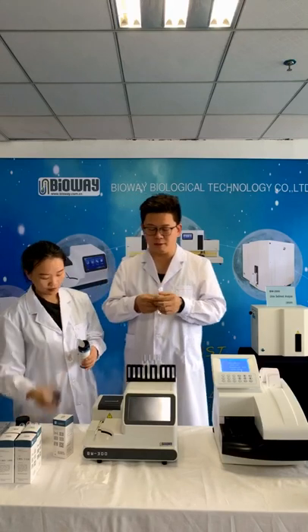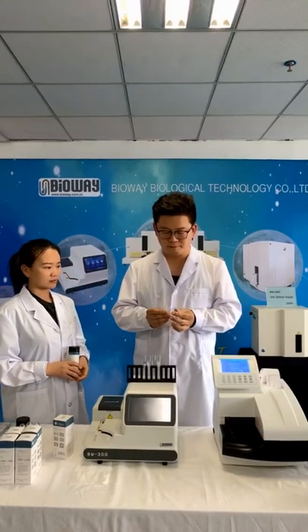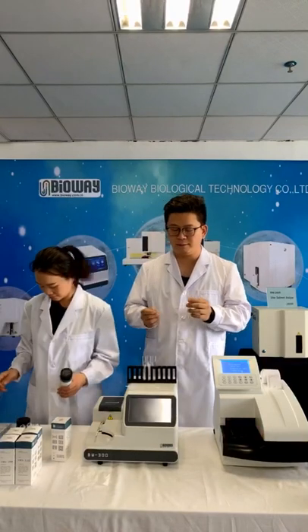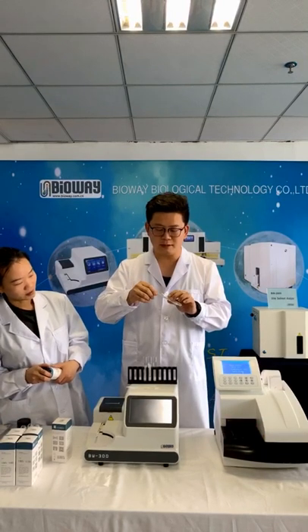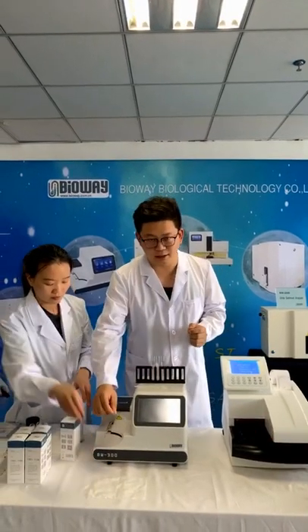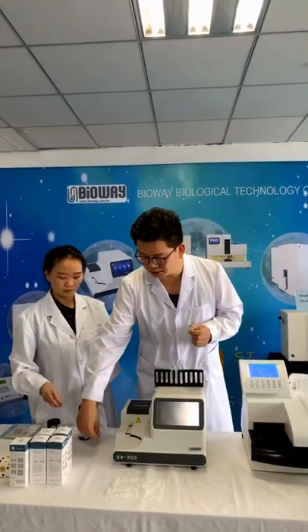Before we test, we prepared several strips. Just regard the liquid in the tube as the urine sample. I suggest you use the strips: insert them into the tube and make sure that each test pad is in good contact with the urine sample. Then there is a tissue here, and we just remove the extra liquid, making sure it's dry, not too much sample.